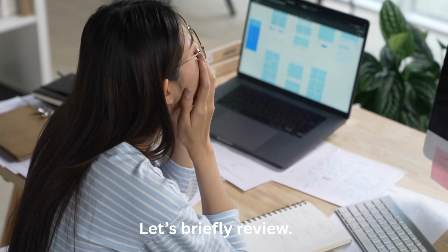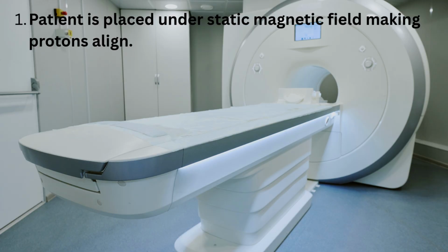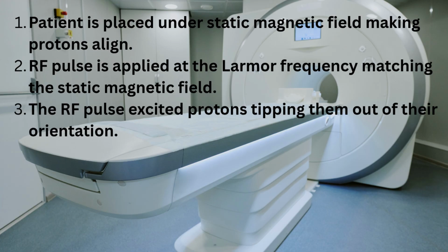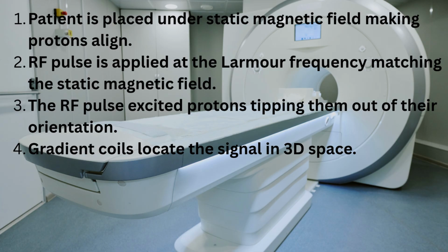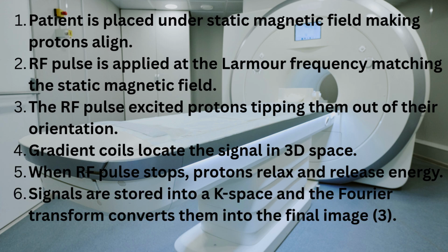Okay, that was a lot. Let's briefly review how MRIs create an image. First, the patient is placed under a static magnetic field, making protons found in water line up along the Z-axis. Then, a radio frequency pulse is applied at the Larmor frequency matching the static magnetic field. The RF pulse excites protons, tipping them into the XY plane. Then, gradient coils locate the signal in 3D space. When the RF pulse stops, protons relax and release energy. Signals are stored in a K-space and the Fourier transform converts them into the final image.